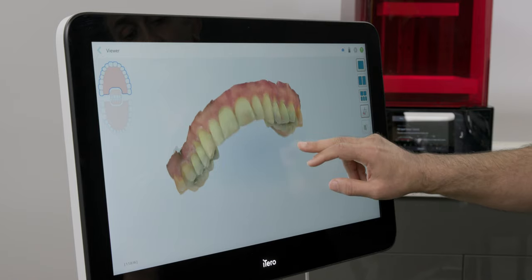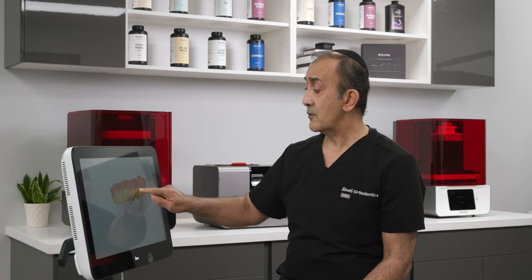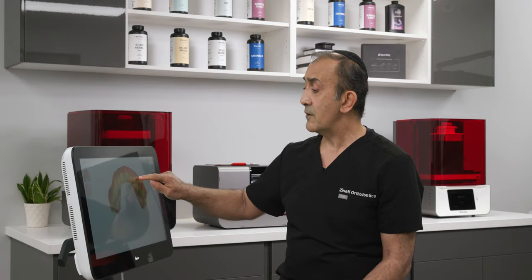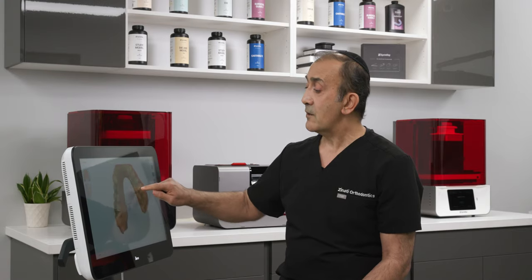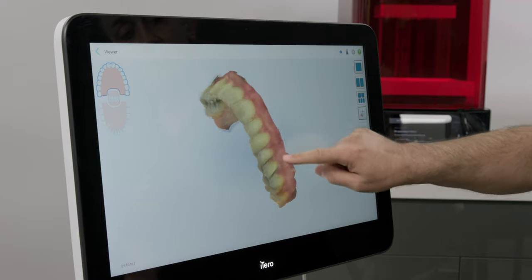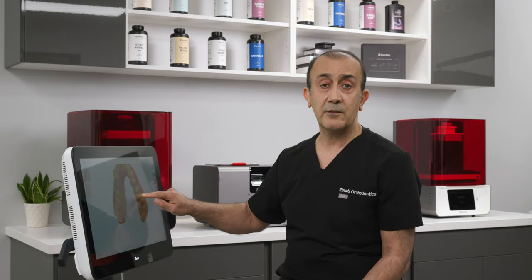We want to make sure there's no saliva accumulation in the proximal area. We want to capture at least about 10 millimeters of gingival tissue including the frenum, any areas of gum recession, and all the interproximal areas. This step is very important because it will help us avoid fit issues with our aligners or retainers later on.